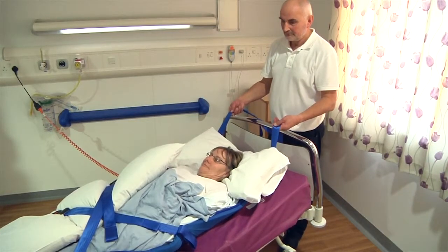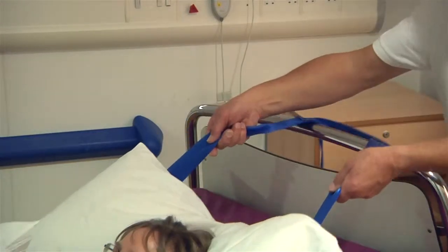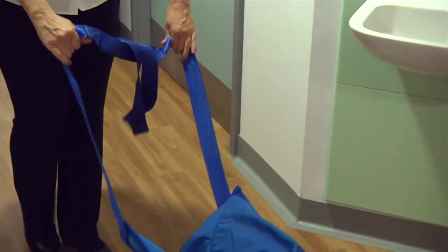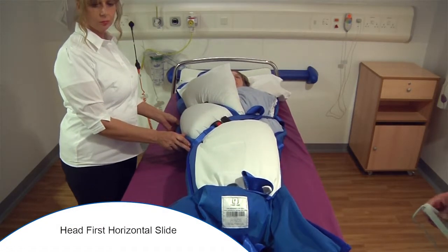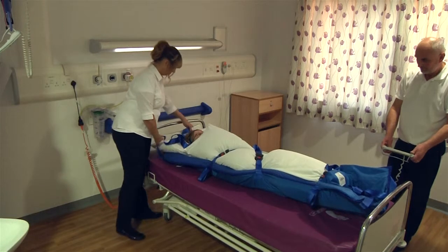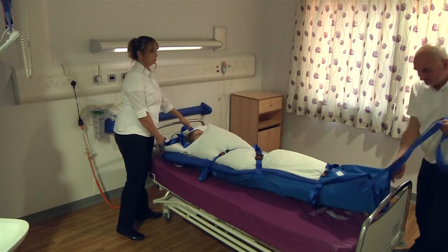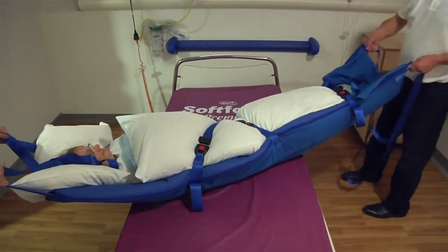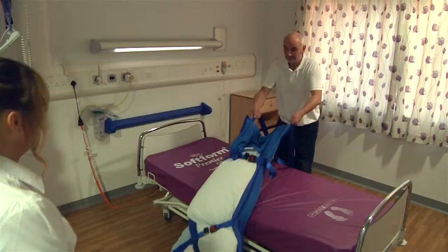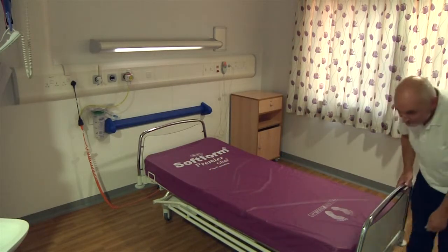The patient is then pulled off the foot end of the bed. Make sure to protect their head throughout this procedure, particularly as the head comes off the end of the bed. Lower the bed down to its lowest position. With a handle at each end of the ski sled, take hold of the pulling straps and move the patient into a position where they are lying across the bed at approximately 90 degrees, ready to slide off. The person at the head end keeps the straps short and starts to move backwards, allowing the ski sled to touch the floor, while the foot end operator allows the straps to move through their hands, controlling the descent of the ski sled onto the floor.